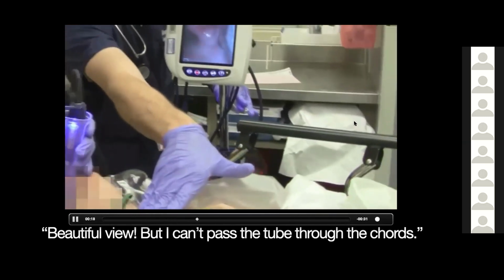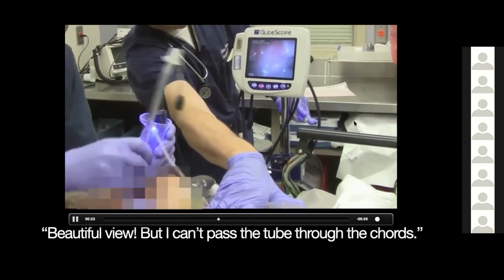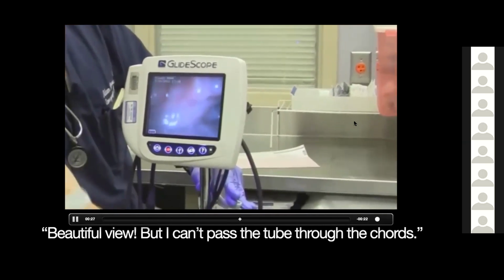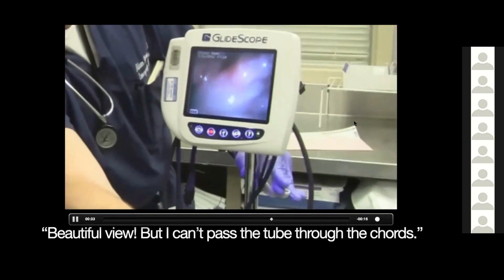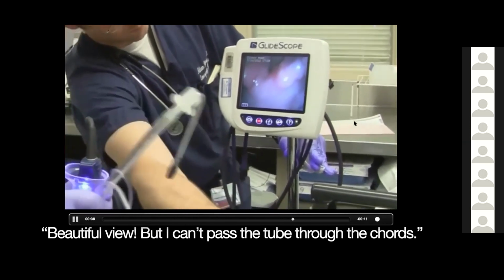We see very well, and then you ask for cricoid pressure. And in theory, with the Glidescope, you really shouldn't be needing this cricoid pressure. So you keep hitting the cords or right behind the cords. What can you do here to help? And you can see in the video, this is where he struggles the most. It takes him about 40 seconds until he's actually able to do something else to troubleshoot it.